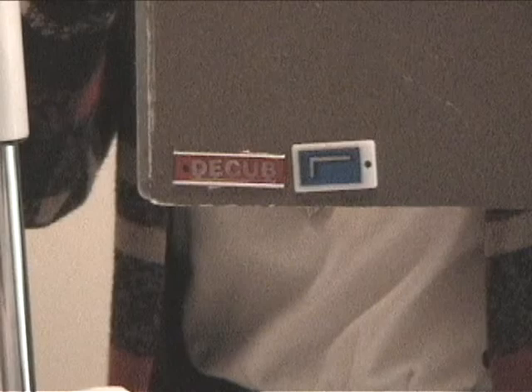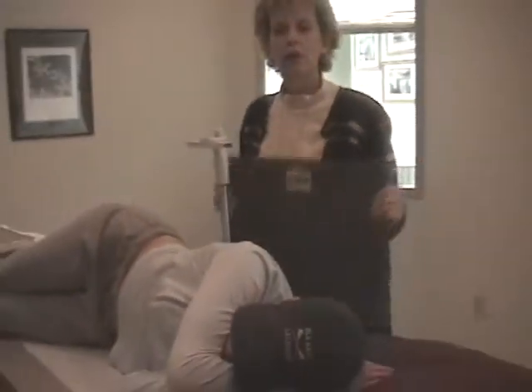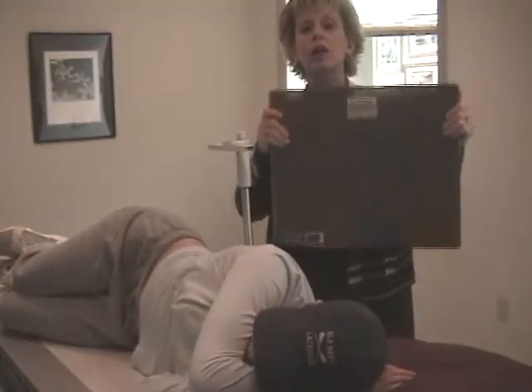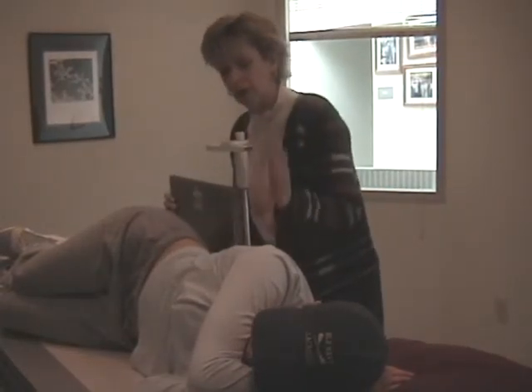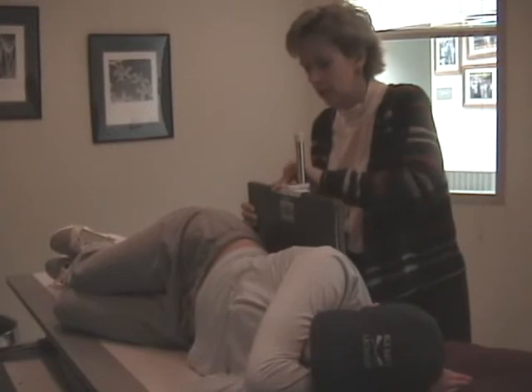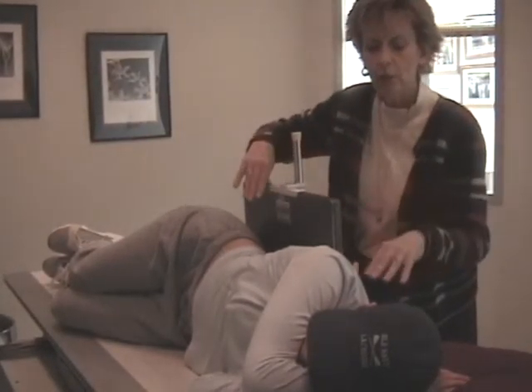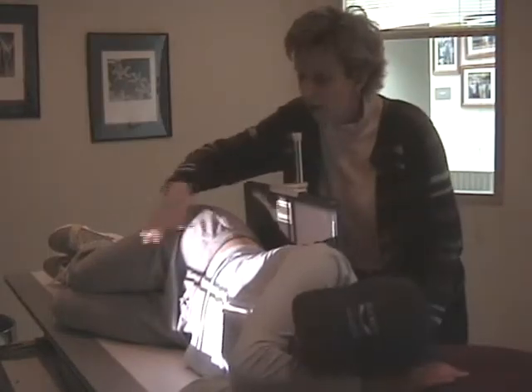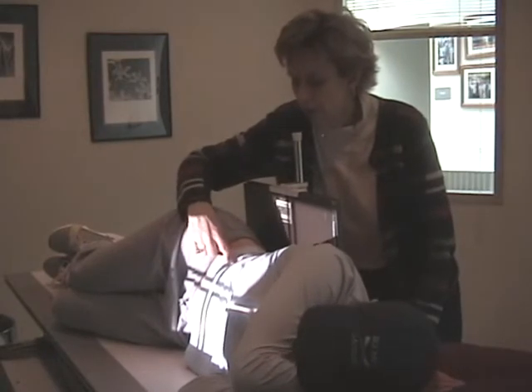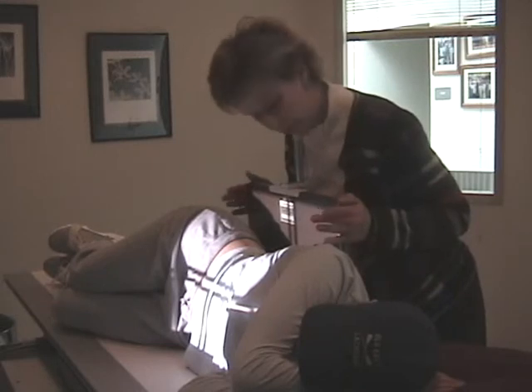See the left marker in the decubitus now? Okay, that's what you want to do. The ID blocker is to her caudal end with the L marker and the decubitus on the left side. If you recall, decubitus will let the observer know that we had a horizontal beam. She's in the left lateral position and the beam is horizontal, making it a decubitus. I have got the center of the collimator right to the iliac crest, and I want it exiting to the center of the film.